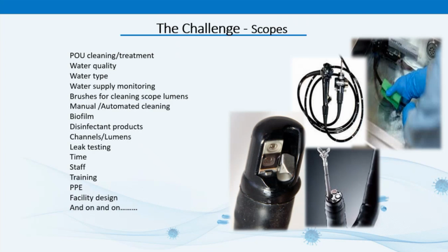significant amount of time. And endoscopes are particularly difficult to disinfect and they're easy to damage. This is due to their complex nature and narrow channels that are challenging to clean manually. Because of the types of body cavities they enter, endoscopes acquire high levels of microbial contamination during each use. For example, the bioburden found on flexible GI endoscopes after use range from 100,000 to 10 billion colony forming units per ml, with the highest levels found in those suction channels. Human error is often cited for most of endoscope reprocessing failures.